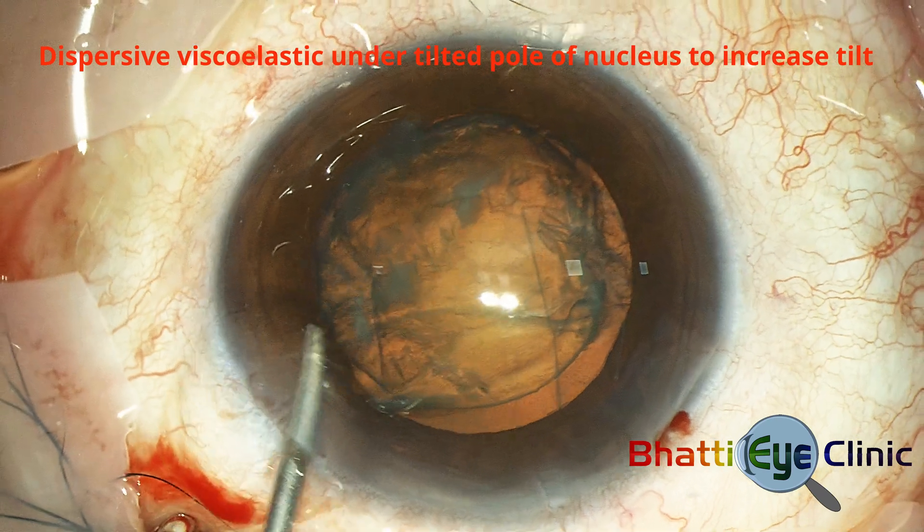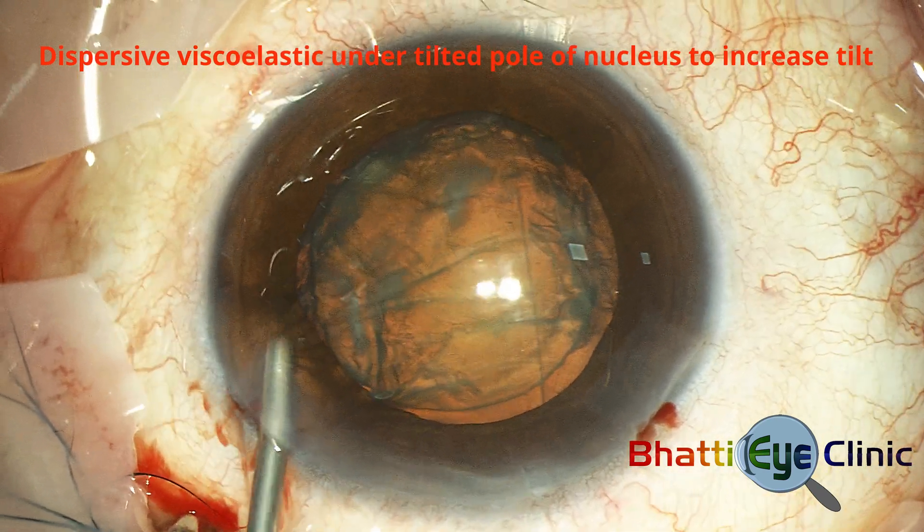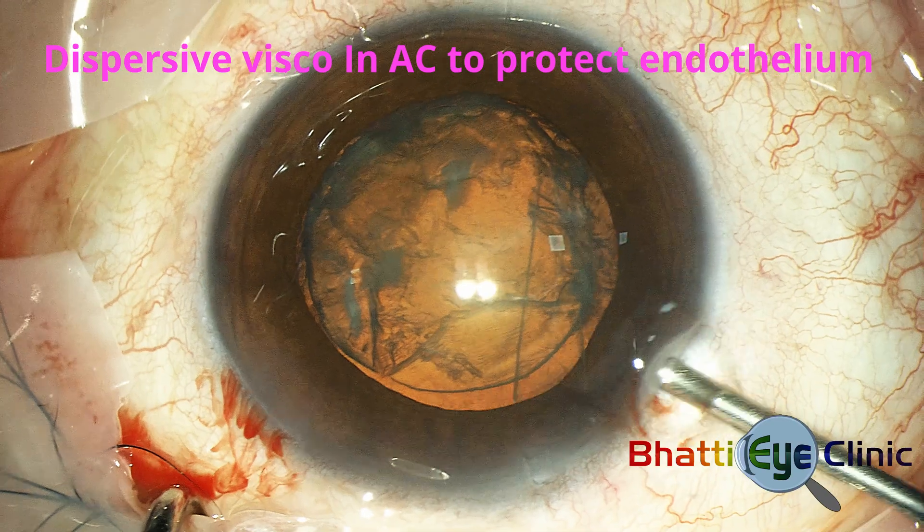A dispersive viscoelastic is then injected into the anterior chamber to position the nucleus and protect the endothelium.